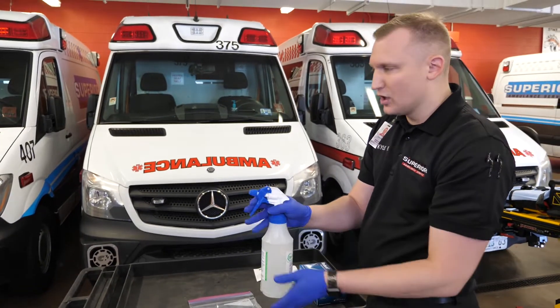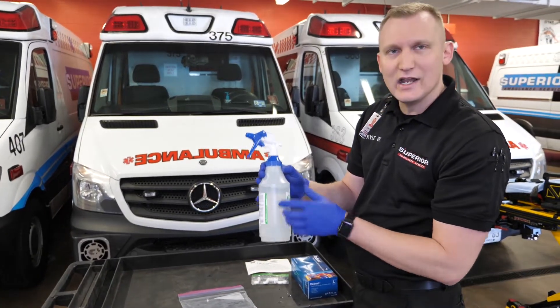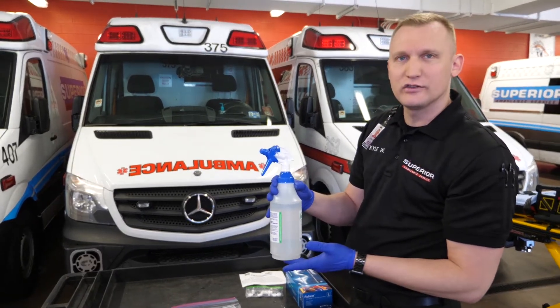The nozzle comes closed — we want to make sure we open it to get a nice misting solution. Once the solution is made, we want to add a piece of tape here and put the date, as the solution is only good for five days. The next crew knows if the solution is past that five days, they need to change out the solution.